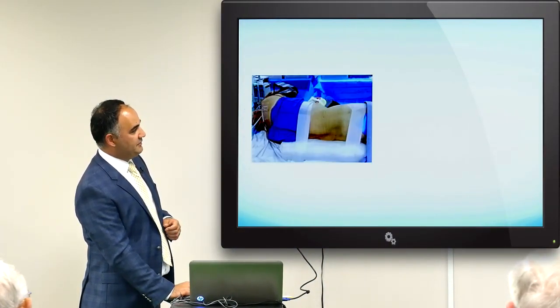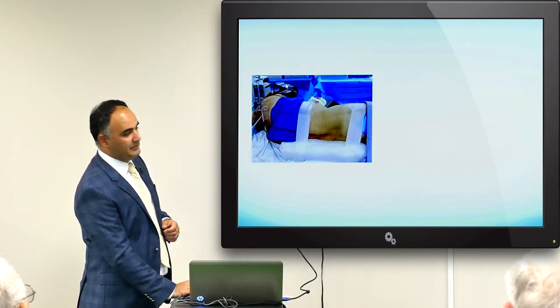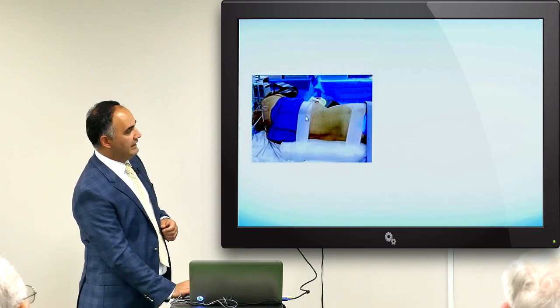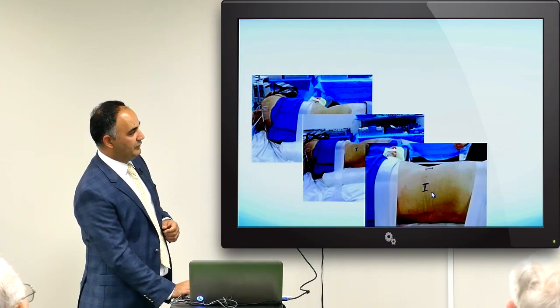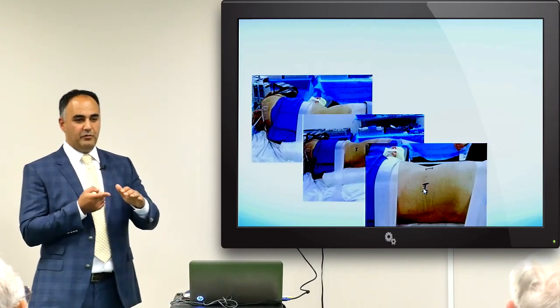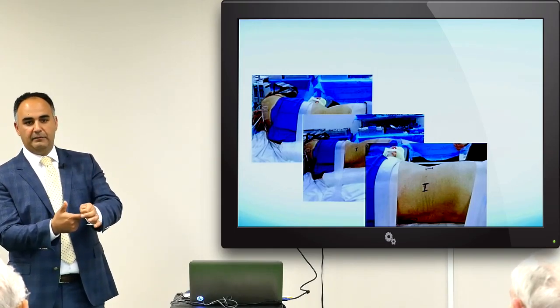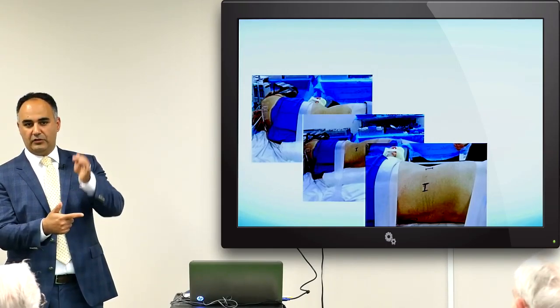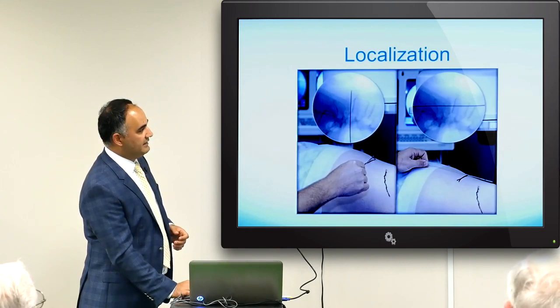Okay. And this is how the patient's positioned. I don't know if you can see, but this is the patient's head over here. His arm is draped over here, and he's laying on his side. His legs will be down this way. We make our incision mark right here, and we make 2 incisions. One in the back where I can put my finger and feel the bowel cavities and push them aside as I'm guiding my probe down onto the disc space so I don't perforate any bowel or anything like that.